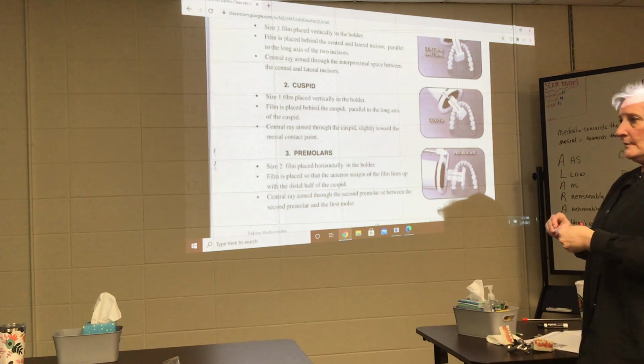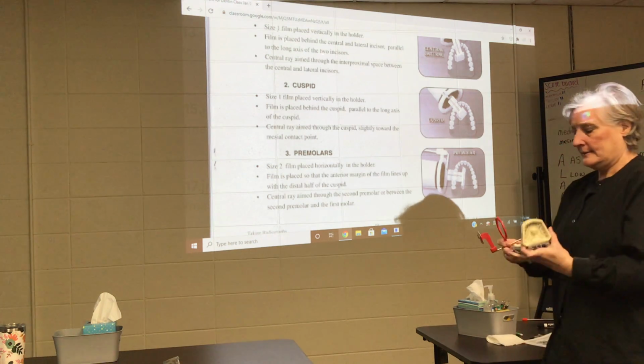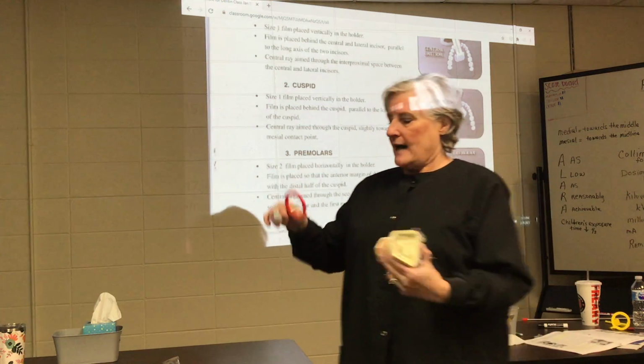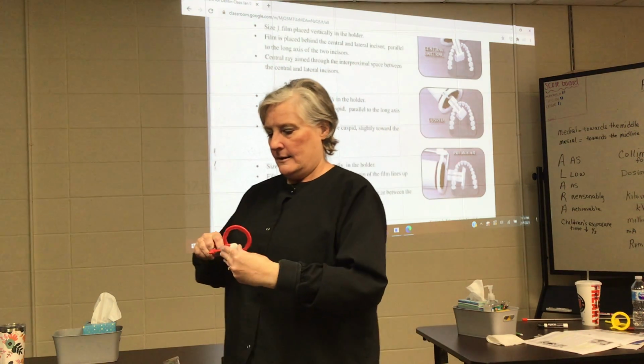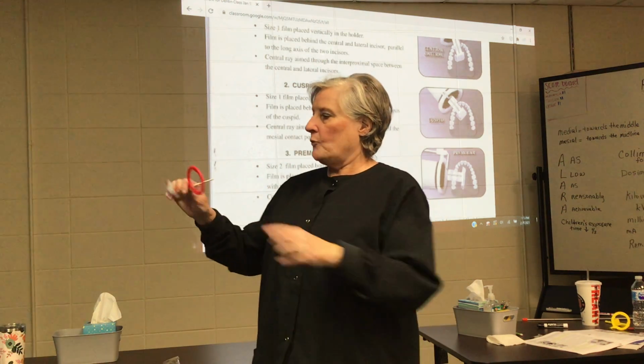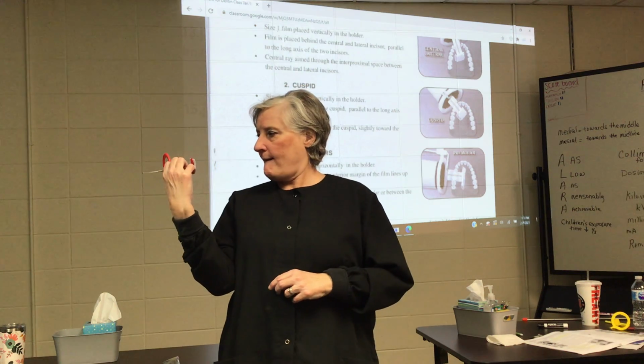Full mouth X-ray. No, full mouth. Full mouth survey, full mouth x-ray. FMX is full mouth x-ray. So, that goes halfway. You wanna place it in the bite block where you can see the film through the ring. Okay?